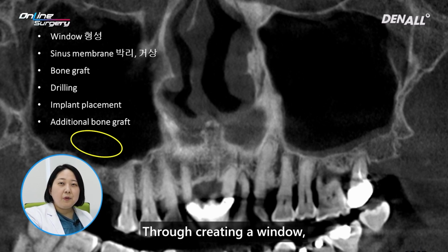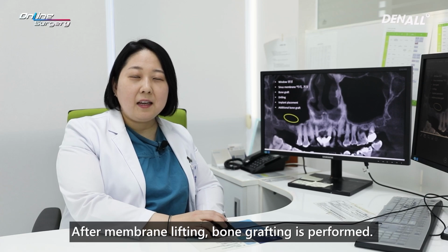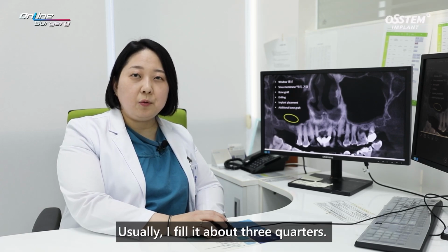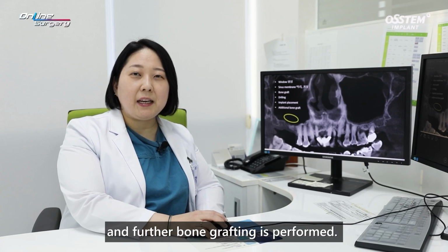After creating a window, Schneiderian membrane is detached and lifted. We need to be careful not to tear the membrane. After membrane lifting, bone grafting is performed. At this stage, not 100% of sinus is filled with bone graft. Usually, I fill it about 3/4. After the bone grafting, I do drilling to place implants. After the drilling, implants are placed at the determined positions and further bone grafting is performed.